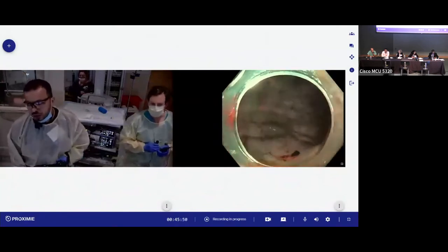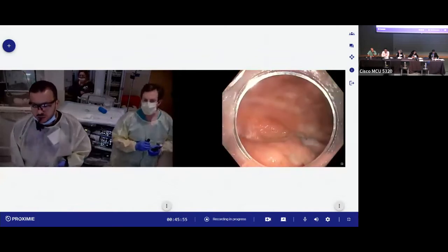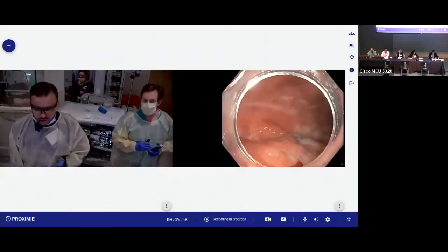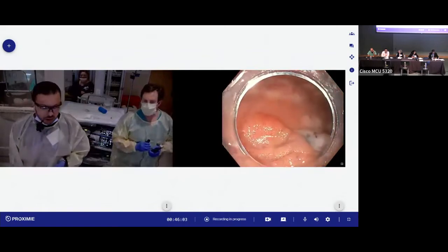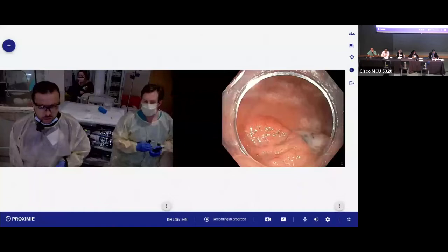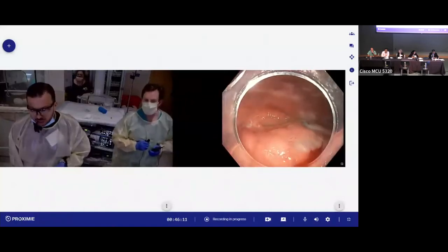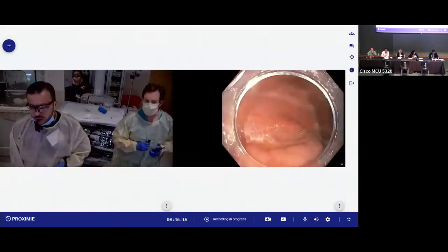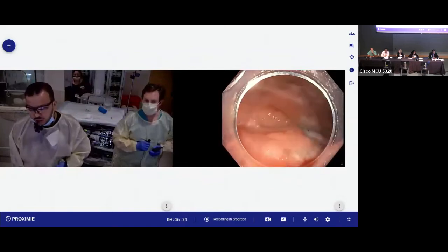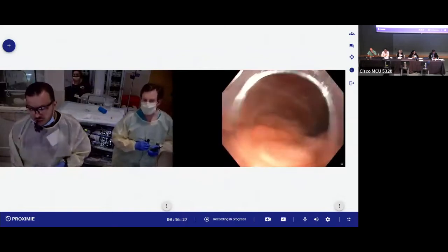In ulcerative colitis, the EMR just gets a little bit more interesting, or just chronic colitis in general, because people are still using that DALM term, and we should not be using these terms anymore in 2022. I think if we see a lesion in ulcerative colitis, we will look first to see if the margins are clear and well demarcated, and if this lesion is visible completely with distinct margins.